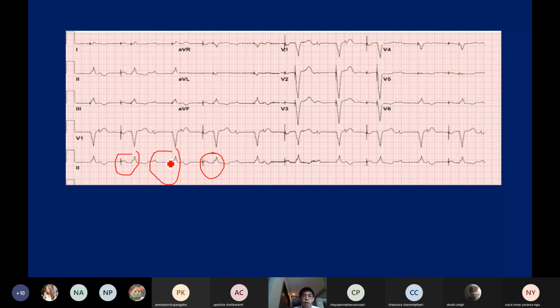So this function should be inhibit only, because the ventricular signal could not be triggered after it senses the P wave. If it were dual in the third letter, it would see this P wave and trigger itself to pace the ventricle with a constant PR.